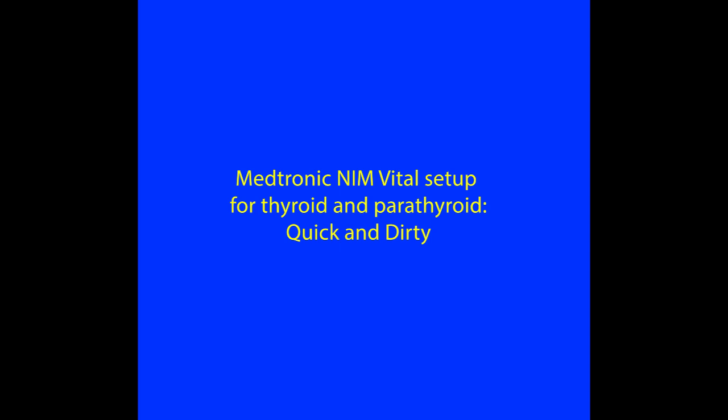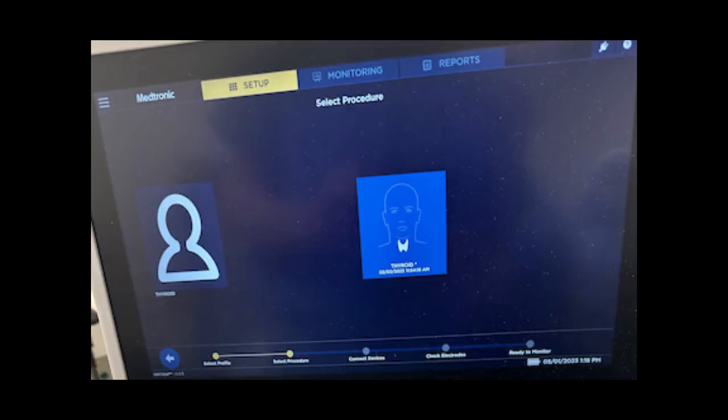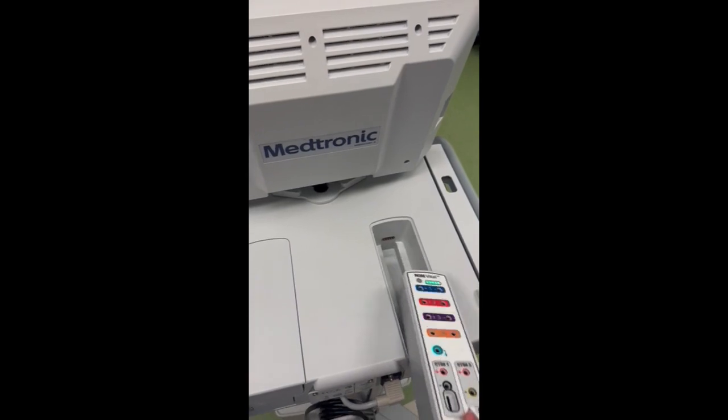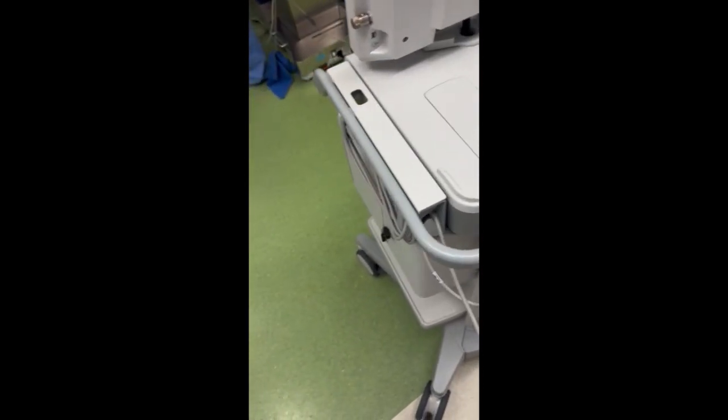How to set up the Medtronic NIM Vital machine for thyroid and parathyroid surgery. The NIM module has a large touchscreen display sitting on the cart. Under the setup tab, highlighted in yellow in the upper part of the screen, you choose thyroid. The patient interface is stored on the back of the cart and is connected to the interface cable.